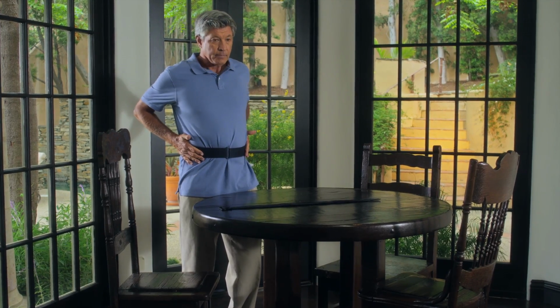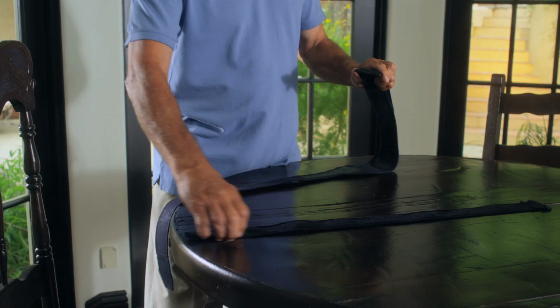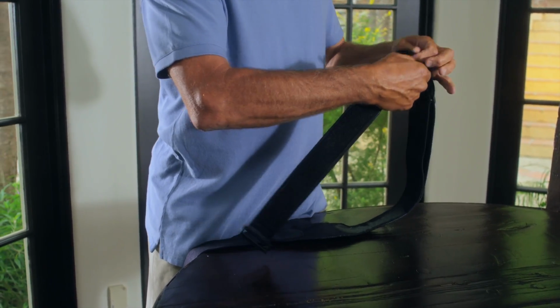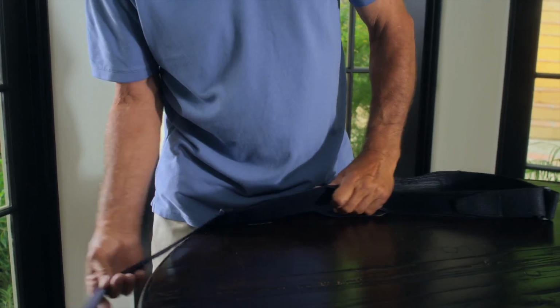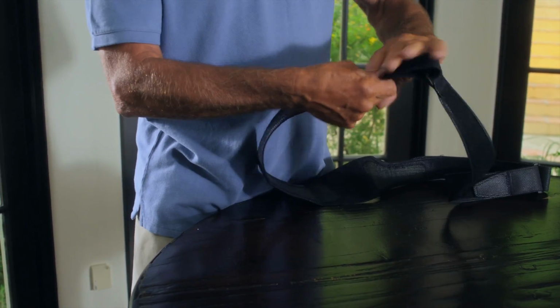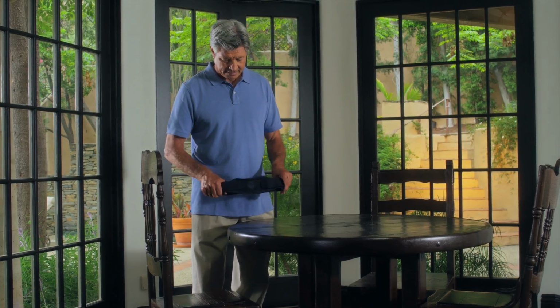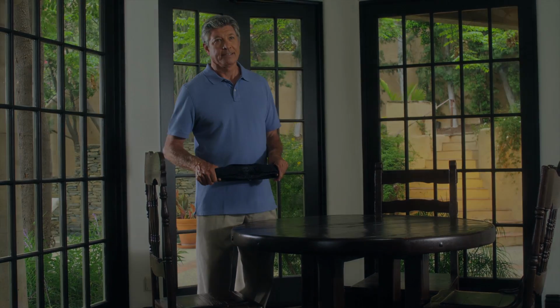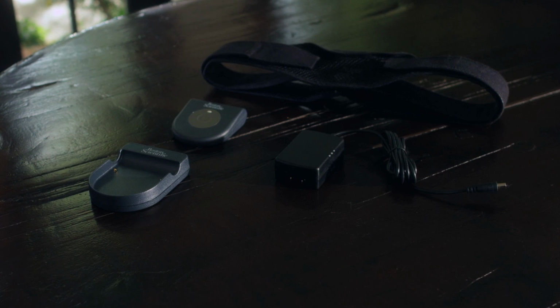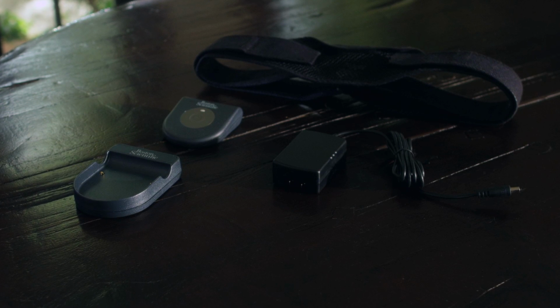If the charger belt is too small, a charger belt extension is available. When using the extension, simply insert one strap through the loop on the extension and fasten the strap onto the belt. That will extend the length of the belt, allowing it to fit comfortably. If the belt is too big, we also offer a smaller size belt. If you need to order a charger belt extension, a small size charger belt, or a replacement belt loop, please call our patient care team.